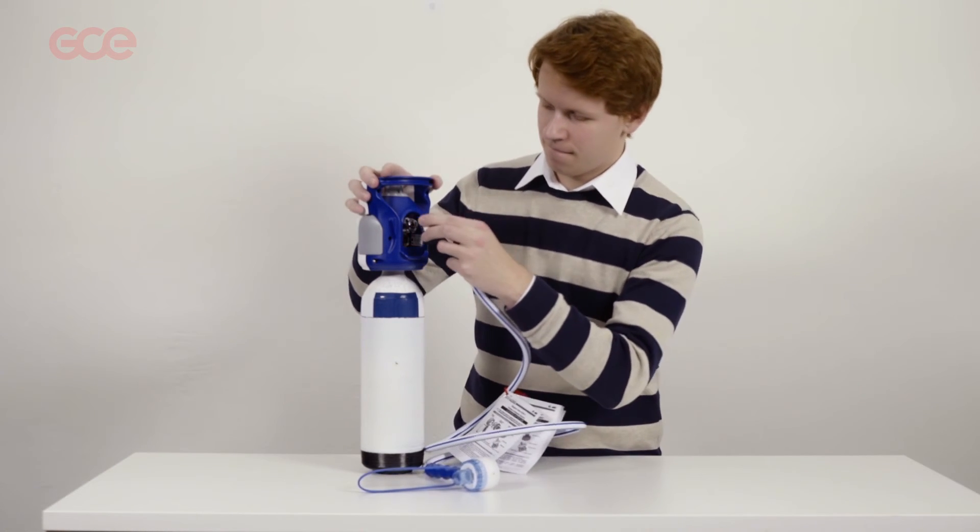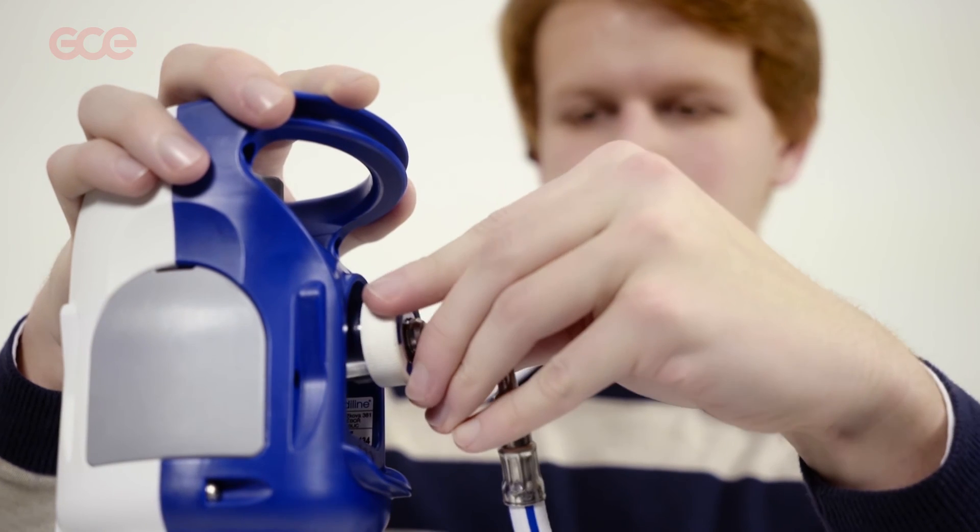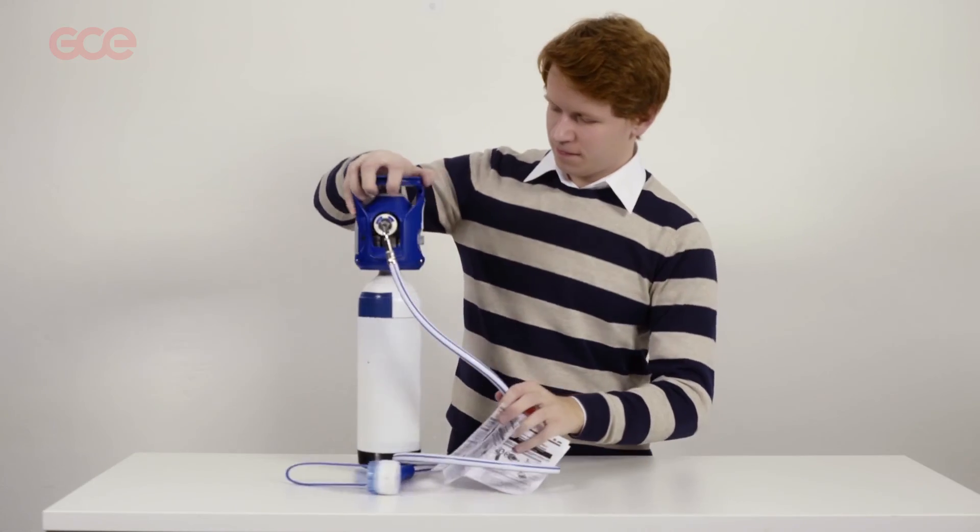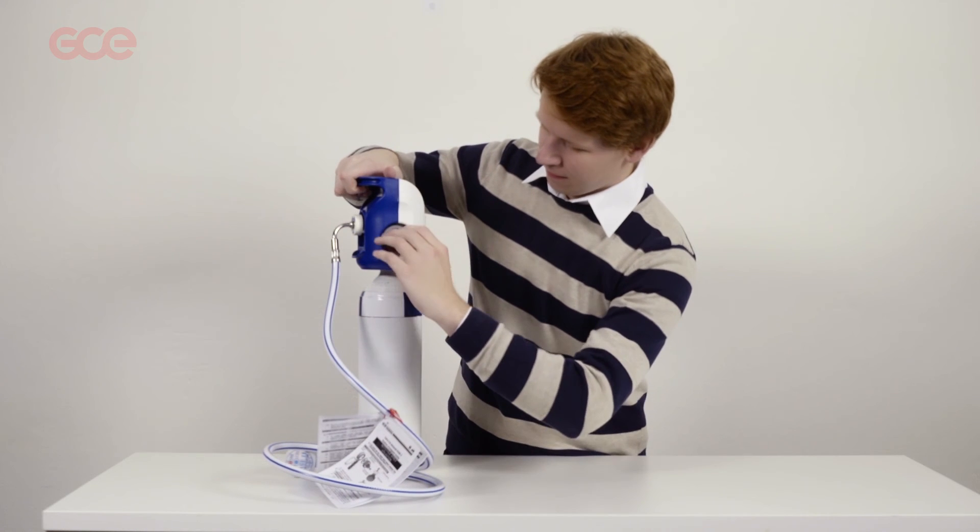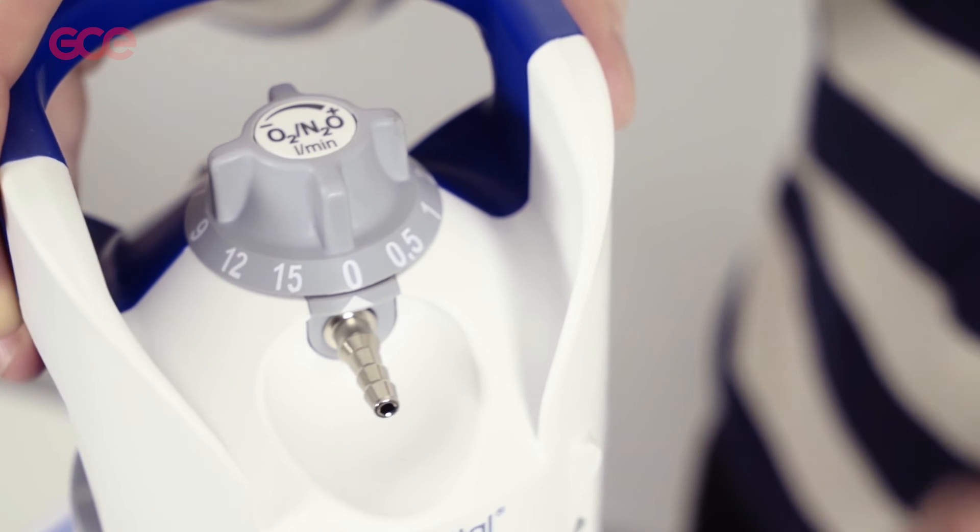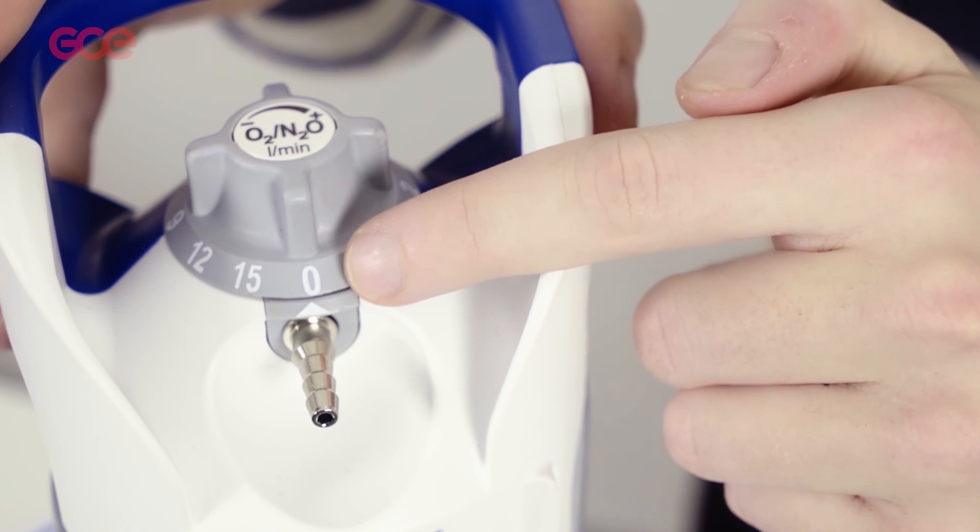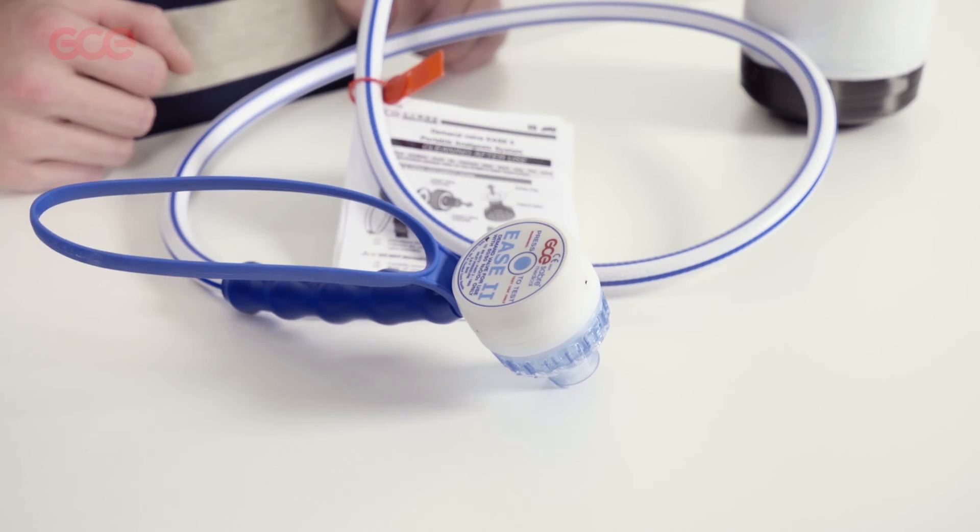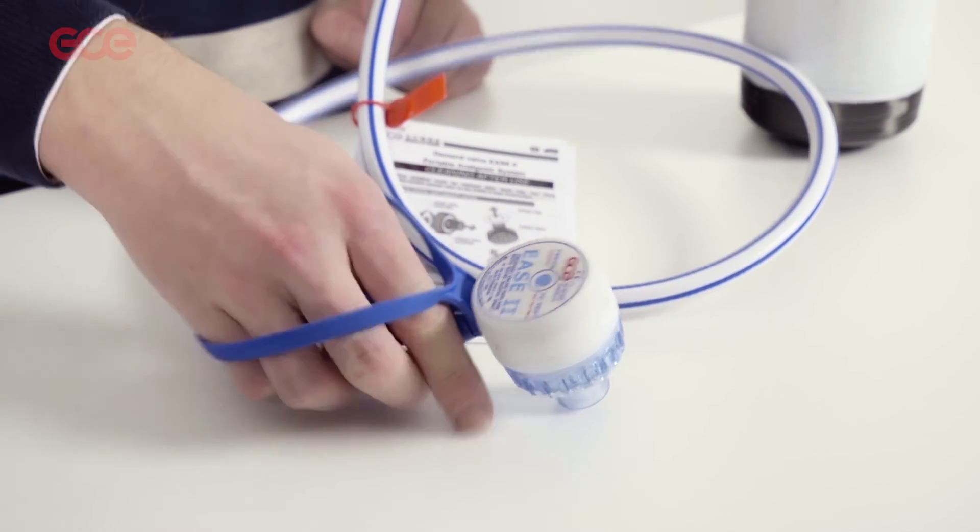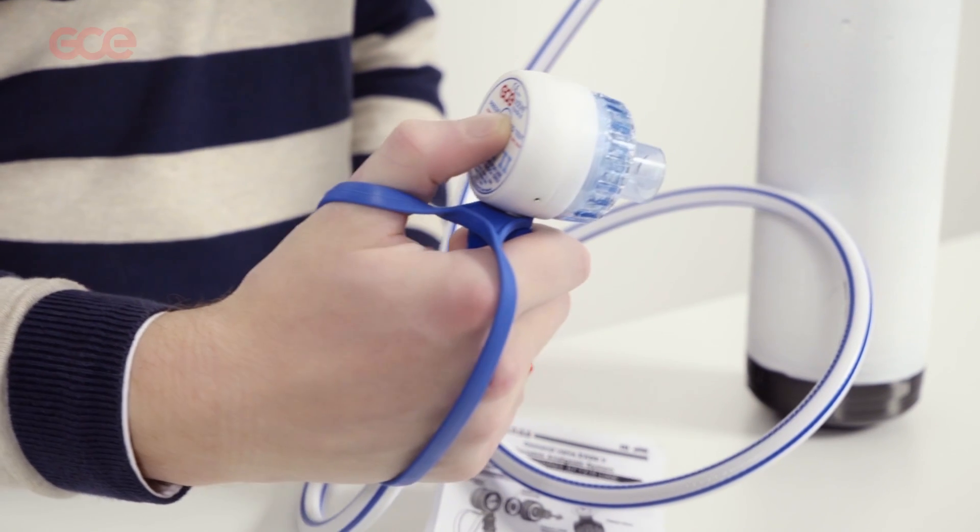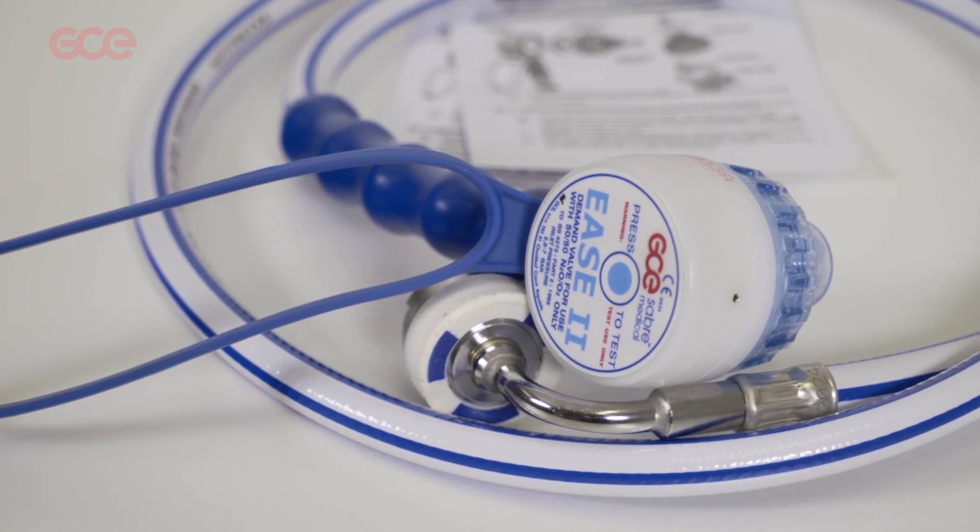Connect the probe to the source of gas. Open the bottle. Caution: do not open the flow selector. It needs to stay on 0 litres per minute for setup. Units should be checked by lightly pressing the test button. Gas should be heard flowing through the mask or mouthpiece.